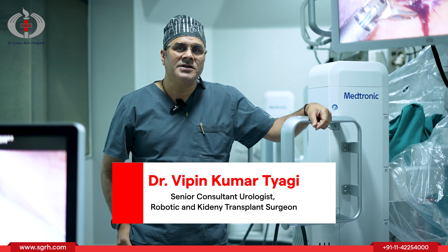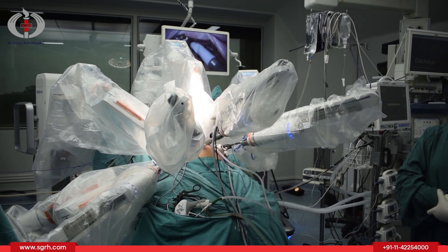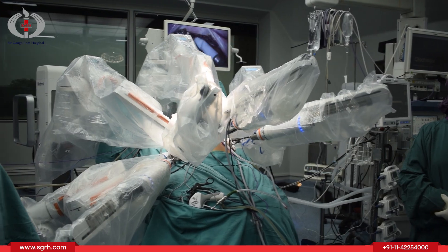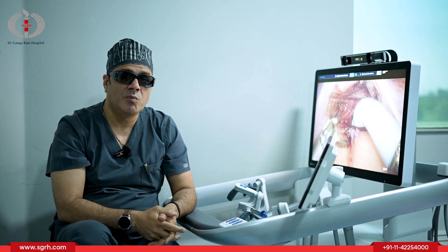I am Dr. Vipin Tyagi, Senior Consultant in Department of Urology, Robotic Surgery and Kidney Transplant. Today we will be discussing about robotic surgery. I will show you the parts of the robot which we use to do robotic surgery.